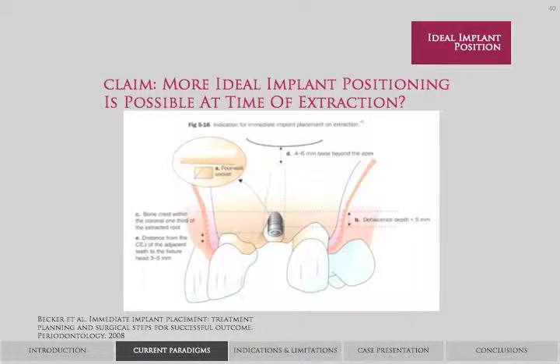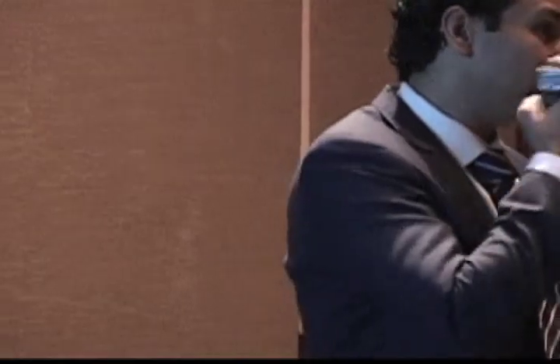You can still be able to graft this bone as long as you have the palatal bone, bone on this wall, bone on this wall, and bone from the palate that's going to lead to bone fill. Then you can pack the bone graft, put your membrane, make sure the implant is placed a little bit deeper, a little bit more palatal, hiding it away from the outer world. Basically, that's one way to categorize it, the 1/3 mark.